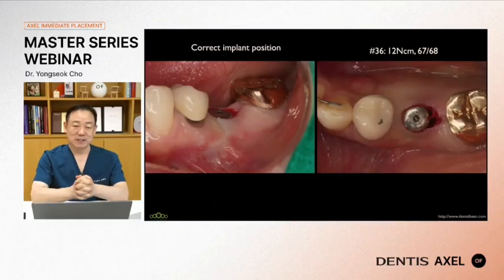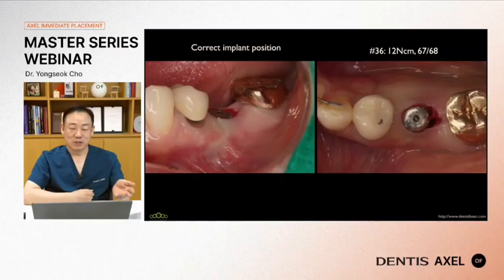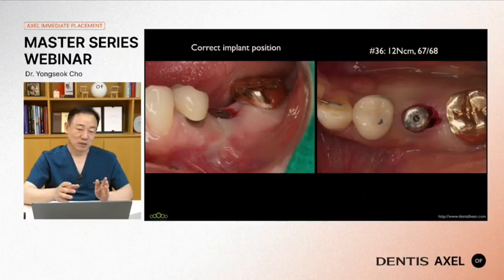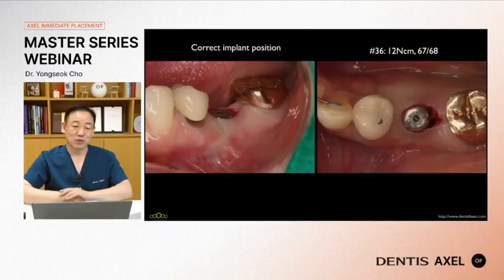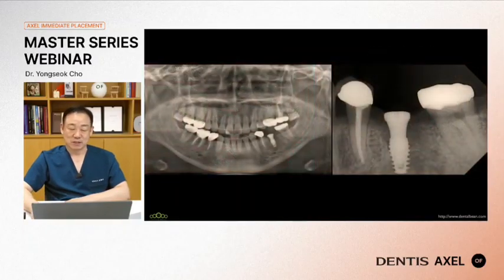Changing direction is not difficult. We can easily change the direction of the path of the implant. However, changing position is not easy. As you see, we will lose the stability of the implant, especially with a minor change. When we move the position greatly, you can get stability. However, with a very minor positional change, it is even difficult to get stability. The XL implant is better than other systems in such a point. I moved the position slightly, but I can get a not bad ISQ value, and I can do one-stage surgery.